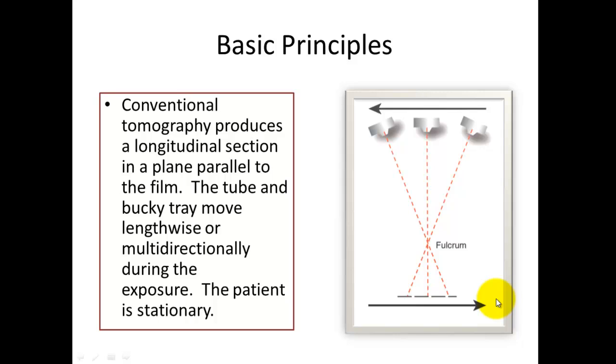One of the traditional exams that tomography was utilized quite often in is the IVP, or the intravenous pyelogram. And this was an examination for the kidneys where contrast was injected to look at both kidney function, the ureters, and ultimately the bladder.